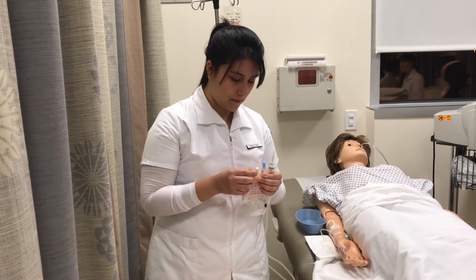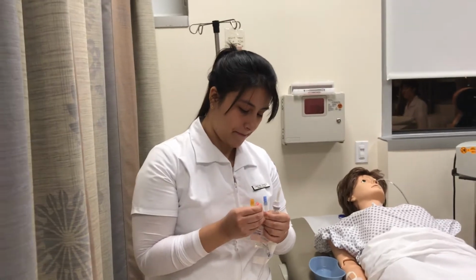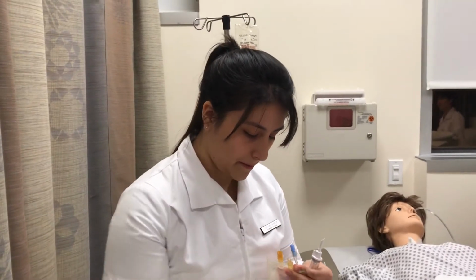So now I will be opening my IV bag, and this to spike it.